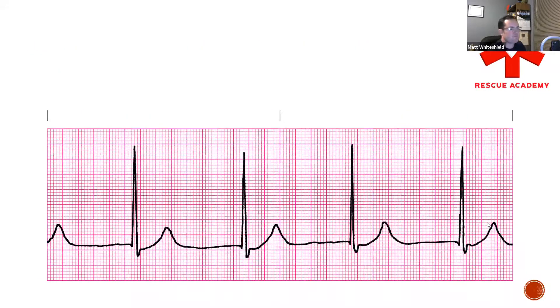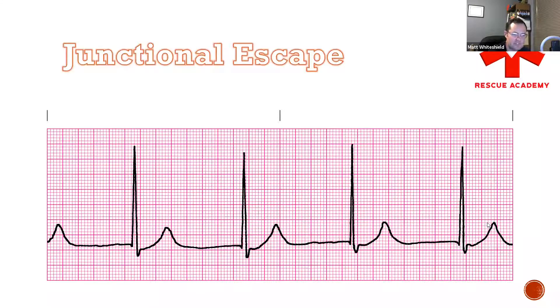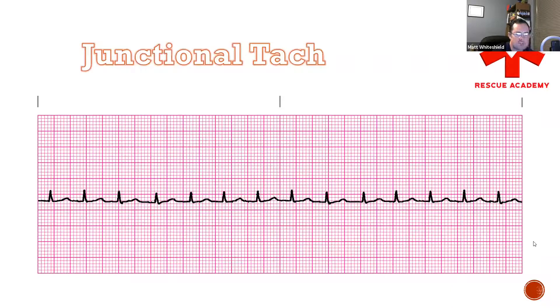We got a rate of about 40 to 50 and there are no P-waves — junctional escape. You can already see how easy it is to tell what these junctional rhythms are. All that matters is the actual rate; you just have to remember the rules — narrow QRS and pay attention to that P-wave. Next one: rate of about 140 — junctional tach.